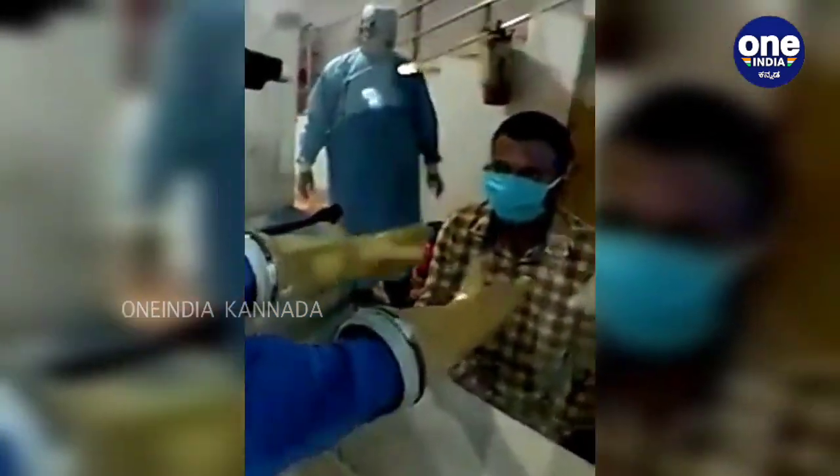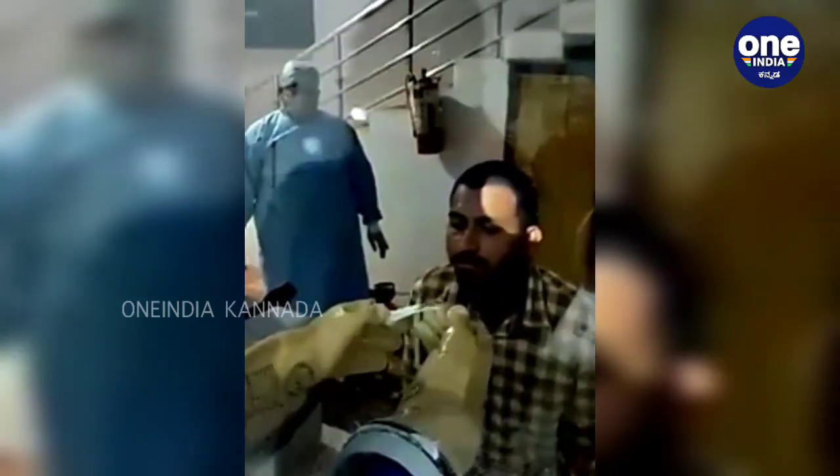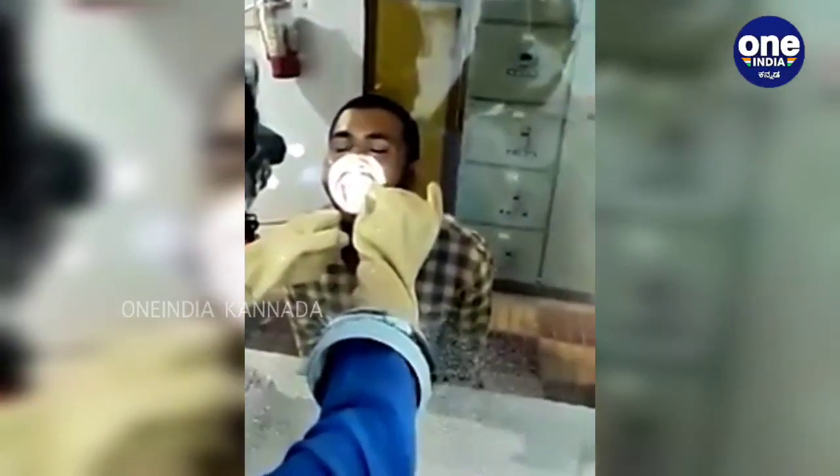The doctor is inserting the hands again through the glass plate. He has taken the swab, removing it, taking it out — that is the swab with which the sample is taken from the throat. That is the moment when the patient is prone to cough, and that is when the glass panel helps in protecting the doctor.